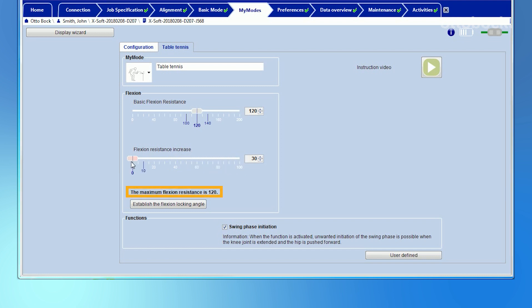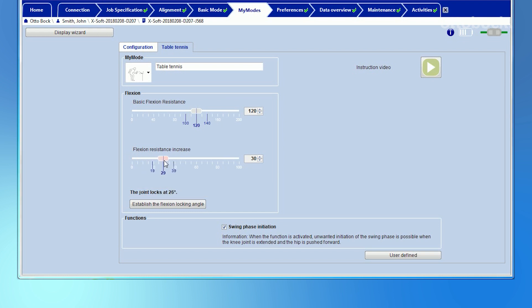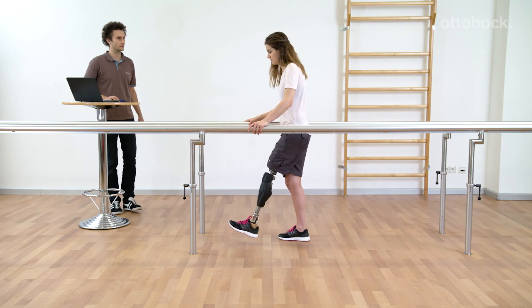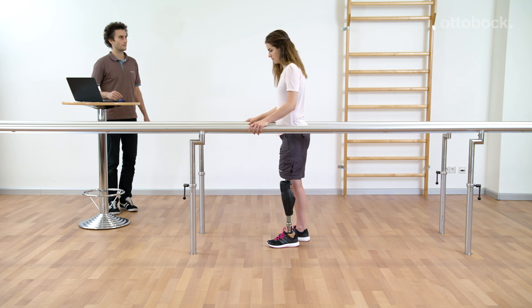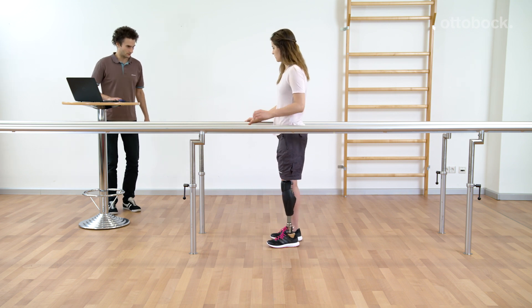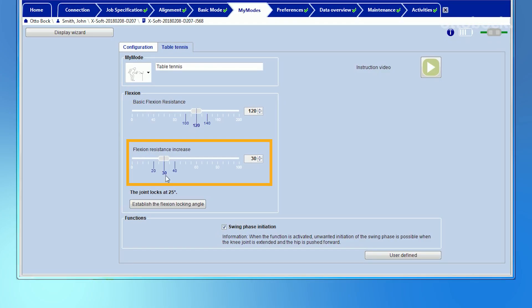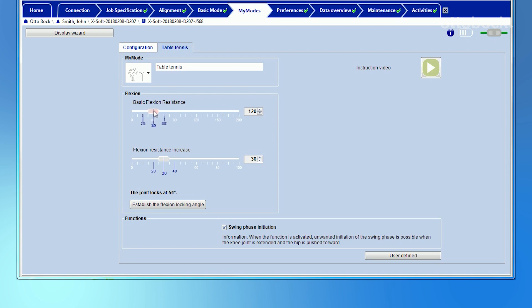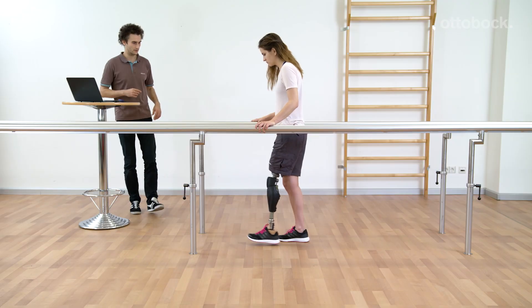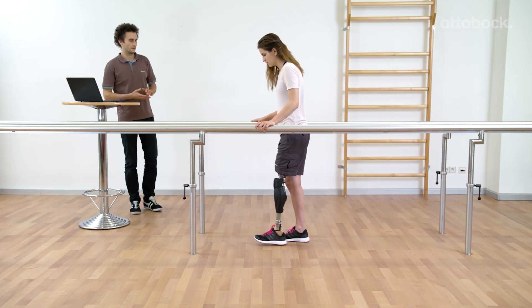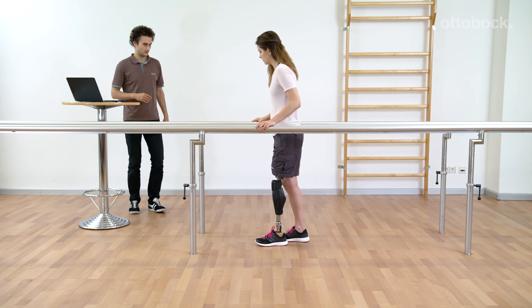The settings for the My Mode Table Tennis are now reset to their defaults. Due to the given basic flexion resistance, the knee joint is not free swinging. To lock in flexion at 25 degrees, a relatively low value for flexion resistance increase is needed. Conversely, to achieve the same angle of 25 degrees, the basic flexion resistance has to be reduced and the flexion resistance increase must be set higher.